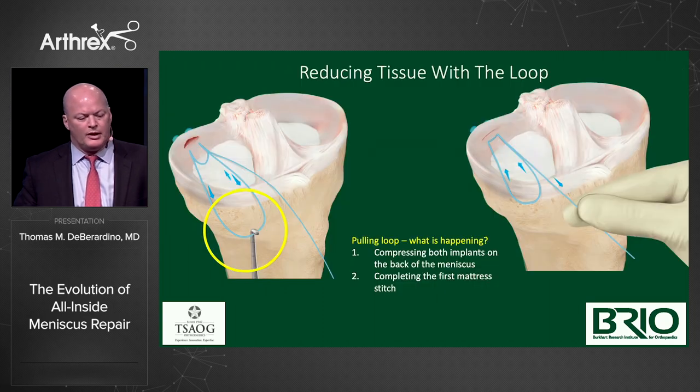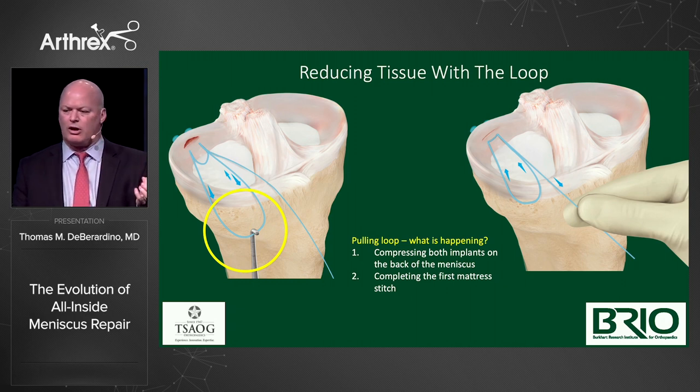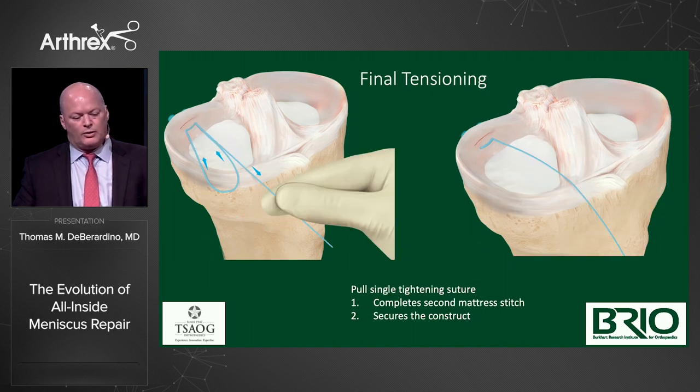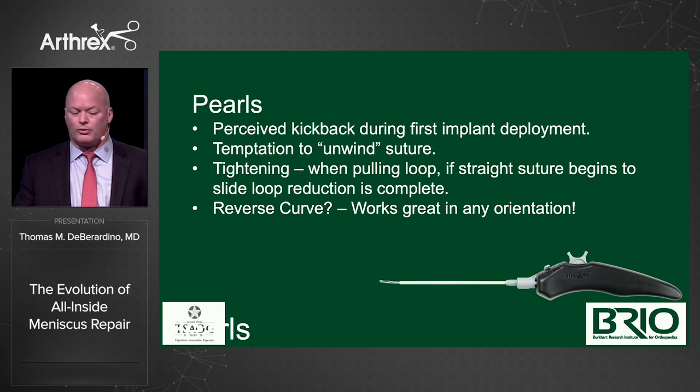Here we're reducing tissue with the loop. We pull the loop — this is outside the passport cannula so you don't have to fish it out arthroscopically. Tightening it tightens the first crossbar, and then the second loop tightens the second crossbar — that compresses it to your heart's desire. Final tensioning: go in with your knot cutter of choice and you have your final construct. Key pearls: perceive kickback during first implant deployment — it's not a real issue. Don't unwind the suture; it has the perfect wind. Pull to tighten the crossbar, then pull down the loop. If the straight suture begins to slide, loop reduction is complete — you know you're done when it starts to pull back on you.